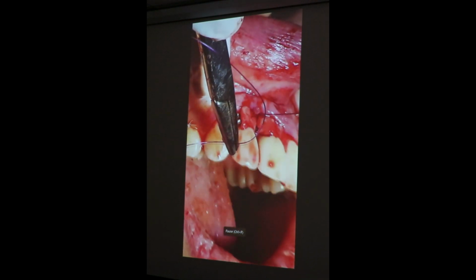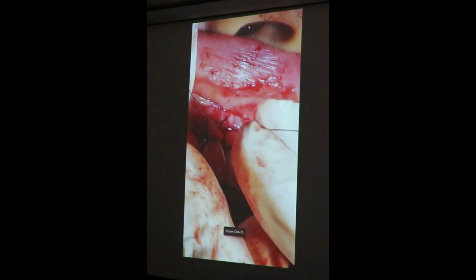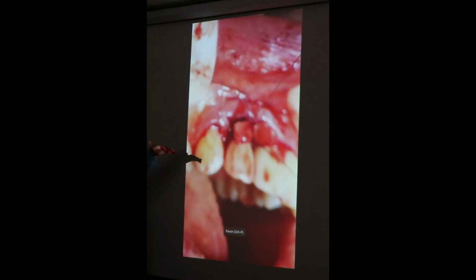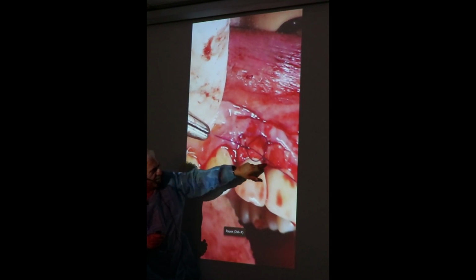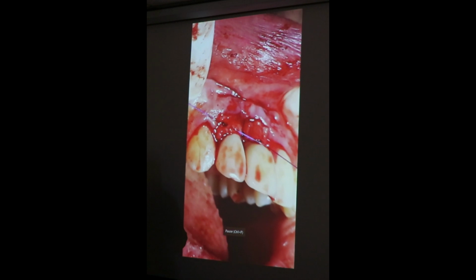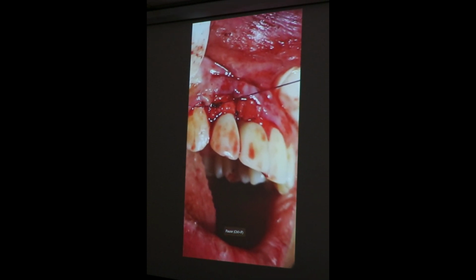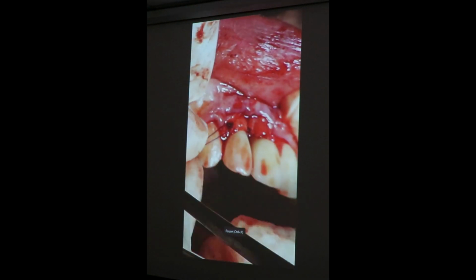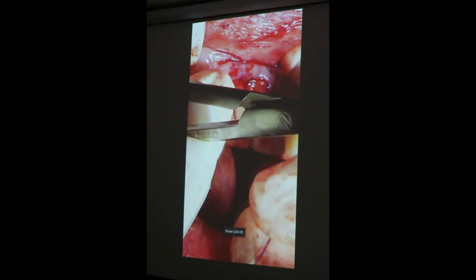The same thing with the 1.5 millimeter of the area that is coming out of the implant. If you don't keep it straight for 1.5 millimeter, you are violating the space that the connective tissue likes to rest. And I think that was one of the reasons why we started having a little bit of tissue loss. This area and this area on the ceramic could have been concave, even though for the first maybe 3 months it could have looked ugly while the patient smiled, but at least in the long run, I think the soft tissue would have matured in a more reasonable position downward versus leaving the soft tissue to basically be lifted up.